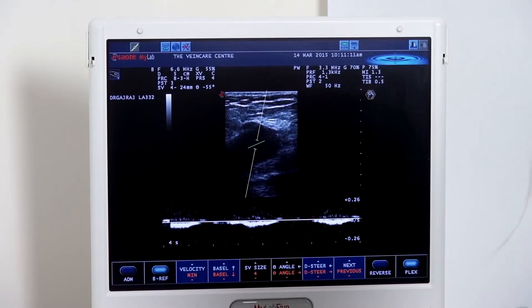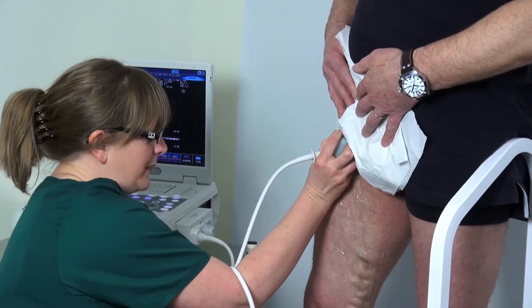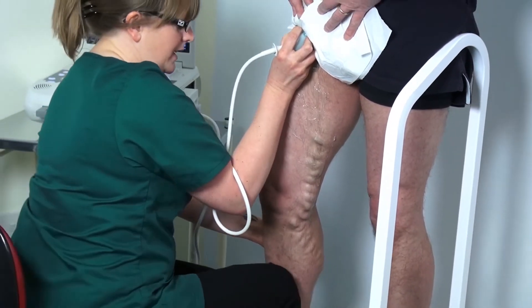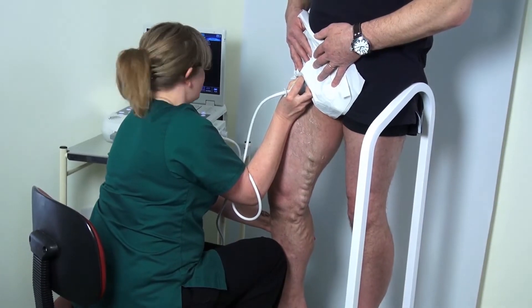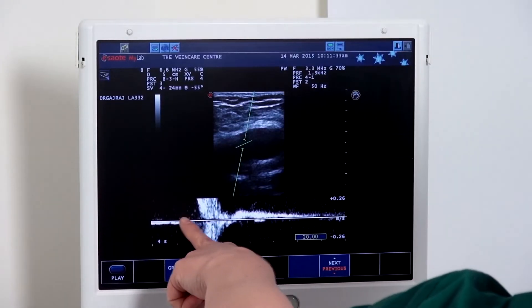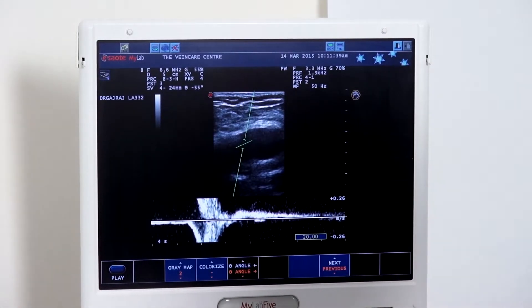We are going to increase the pressure through the vein, and to do this we need to get a good squeeze on the patient's leg. It is inappropriate to squeeze around the front — that's just not going to provide the correct squeeze. We need to get in nice and close, using your knee pressed up against the calf, making sure you are nicely centred to squeeze the calf, and then a quick release. We can see the initial squeeze and the release, and the blood flow ceases and goes back to normal, because those valves are working well.